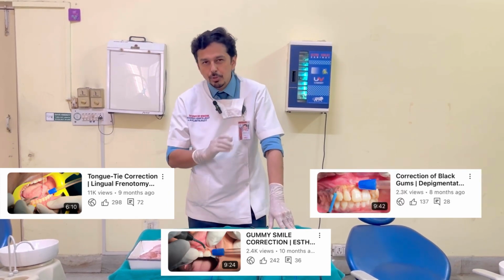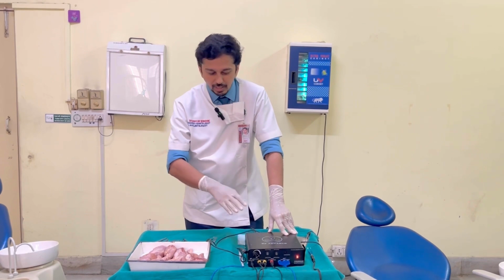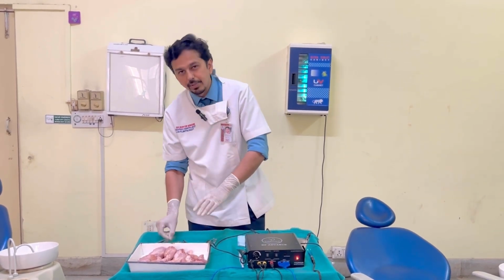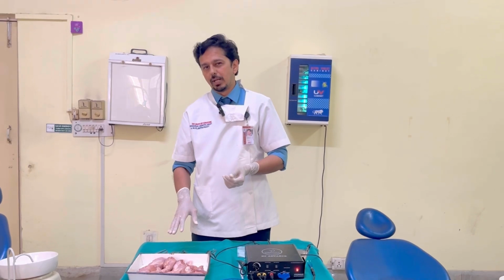So any such procedure where a raw wound would be there, where basically healing would be by secondary intention, I would prefer anytime a thermal modality over a conventional scalpel. Any procedure in which ultimately I have to access bone only, I would prefer a conventional modality.